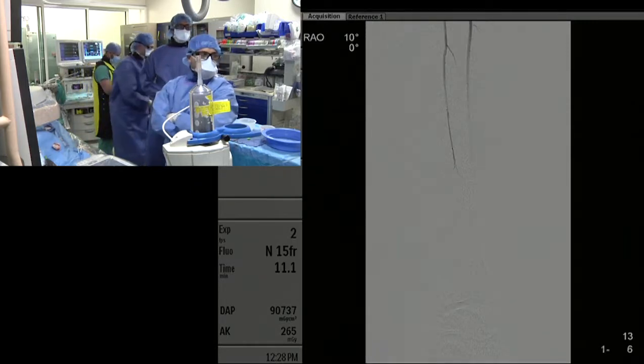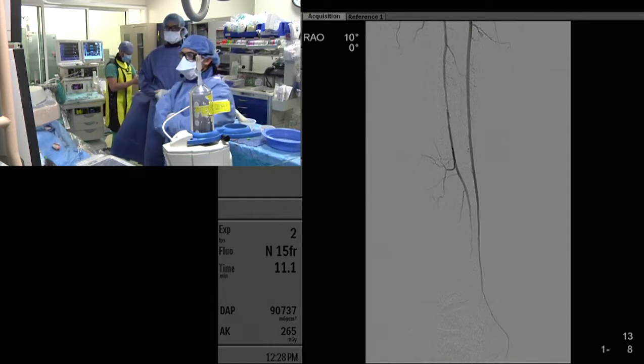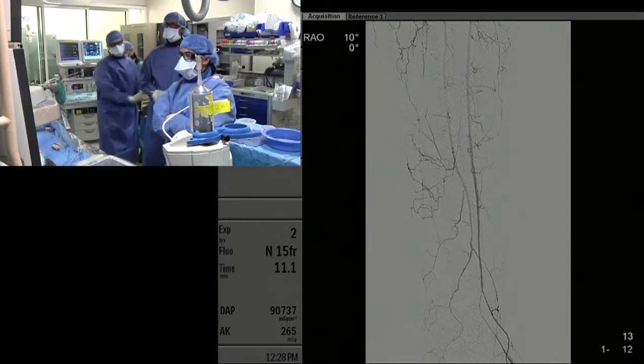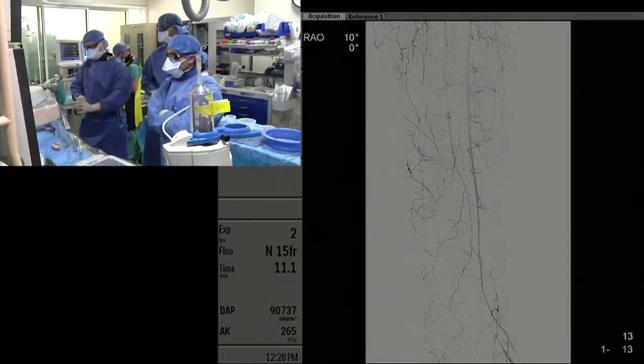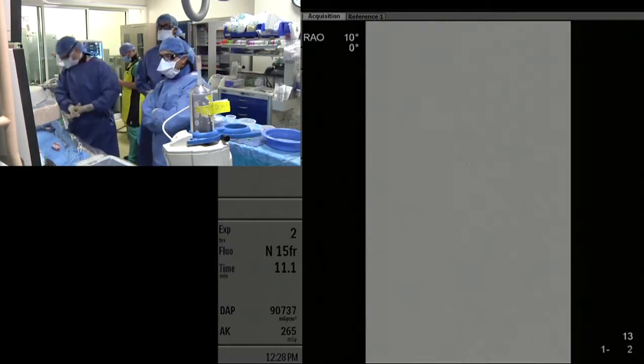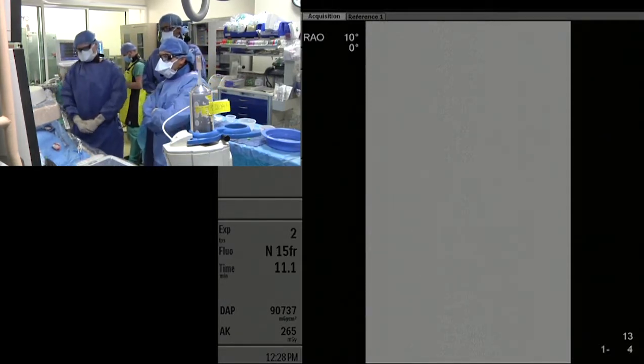I think it looks great. She's got two-vessel runoff. You've relieved her obstruction and improved circulation.